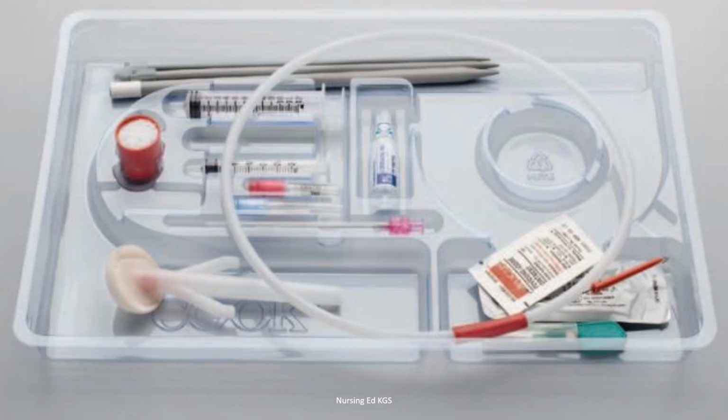So, you have now been asked to prepare a patient's bedside with the items or equipment that are needed for a chest tube insertion. You'll make sure that you have your pre-sterilized packaged chest tube insertion tray as well as the pleural drainage system. You will get 1% or 2% lidocaine solution and a small gauge needle. You will ensure that the suction equipment at your bedside is working, and you'll get 1 or 2 waterproof transparent adhesive dressings.